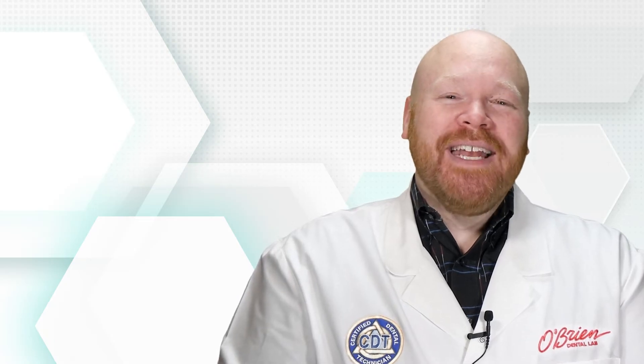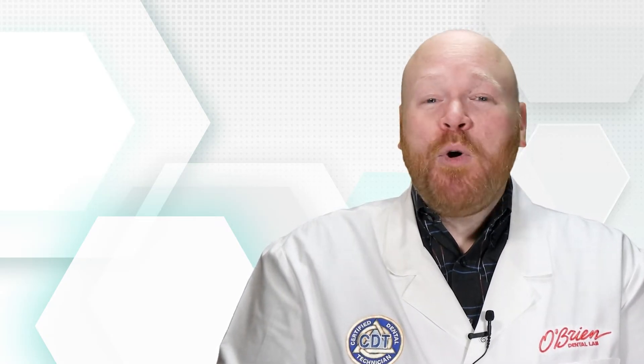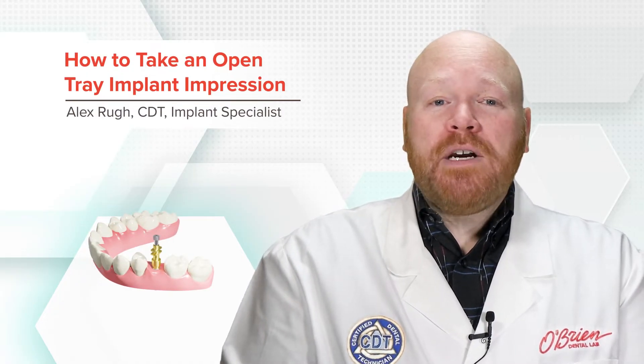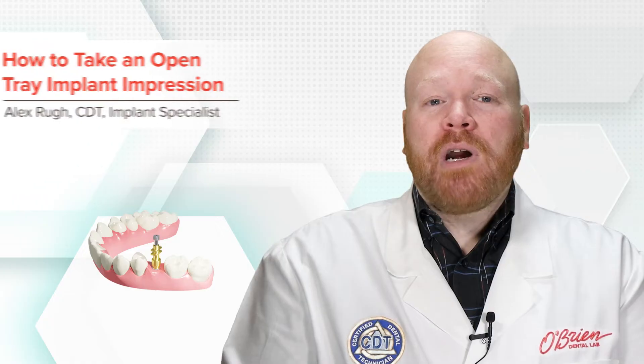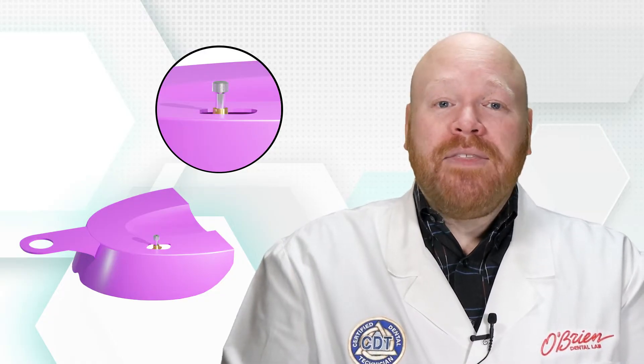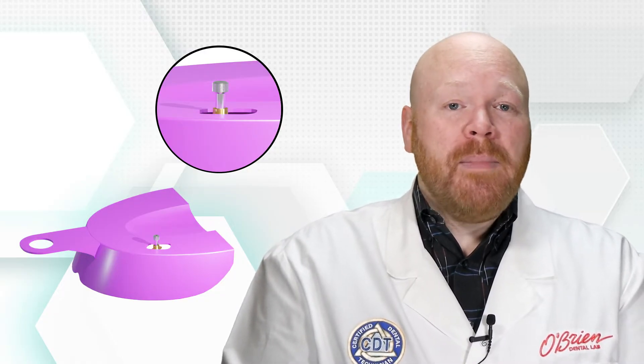Hey everyone, Alex from O'Brien here. In this video, I'm going to give you some useful information for taking an open tray implant impression. Open tray impressions are the type that require a hole in the impression tray, which gives access to unscrew the coping, and this allows the impression coping to stay in the tray when the impression is pulled from the mouth.